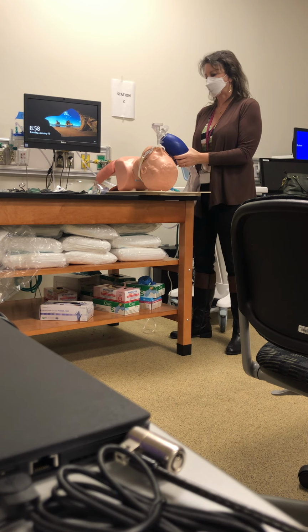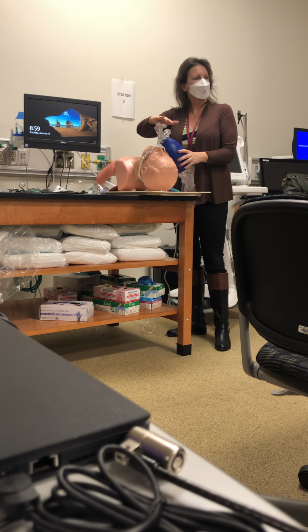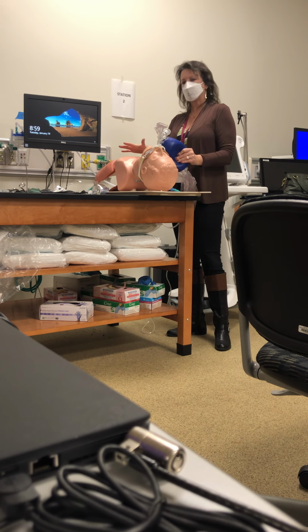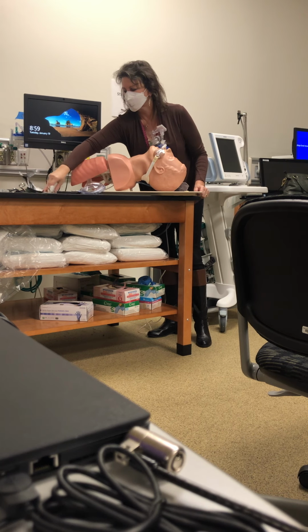So you've intubated. Now, what am I going to do once I intubate? I've done my easy cap, and I have a positive color change. Means I have positive CO2 gases exhaling. So we're in the trachea. I've looked at my chest, it's rising. What would I do next?